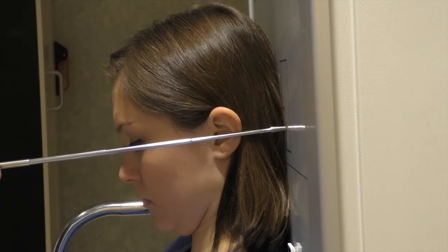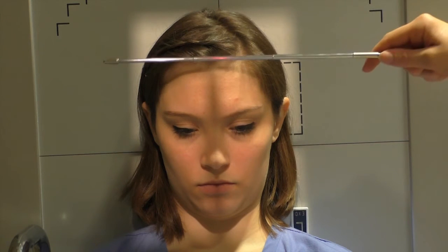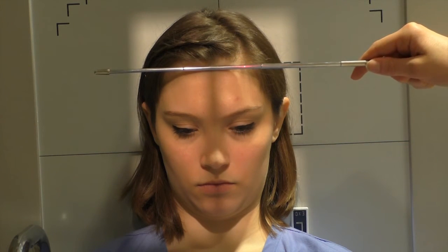For the Towne method, there should be a 30-degree caudal tube angle. Tuck the chin in to get the OML perpendicular to the IR to ensure no tilt or rotation. The central ray is aligned to the mid-sagittal plane. Center 2.5 inches above the glabella. Collimate around the area of interest. Marker is placed on the correct anatomical side.